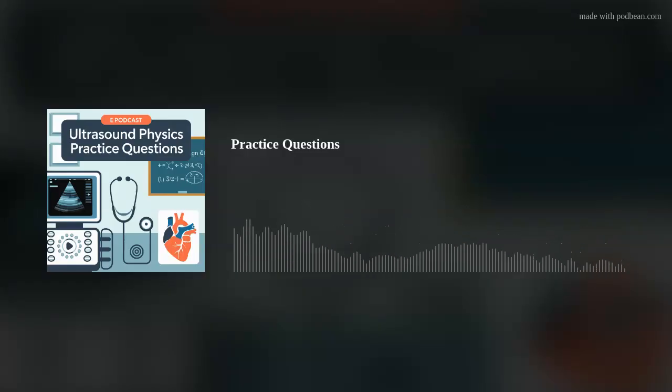So how does all this physics knowledge actually translate to, like, picking the right settings on the machine? That's where things get really interesting. Understanding the physics lets them make good choices about stuff like the transducer frequency, how much power to use, the gain, the focus, all that.